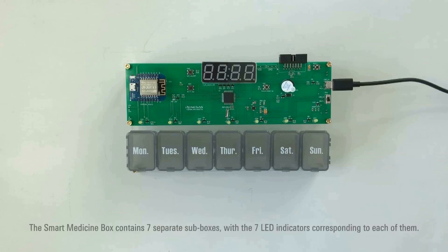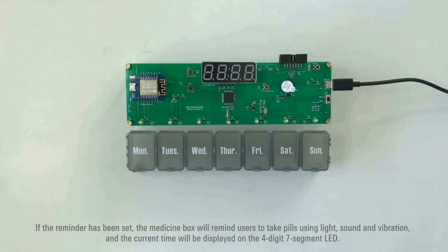The Smart Medicine Box contains 7 separate sub-boxes, with 7 LED indicators corresponding to each of them. If a reminder has been set, the medicine box will remind users to take pills using light, sound, and vibration. The current time will be displayed on the 4-digit 7-segment LED.